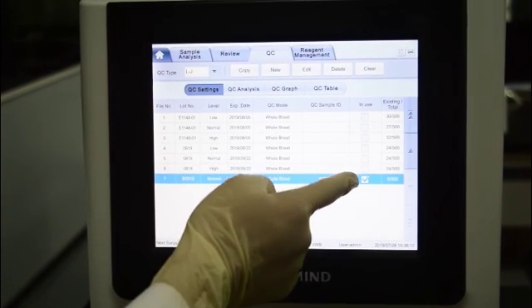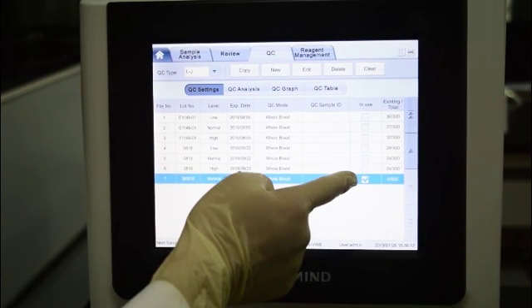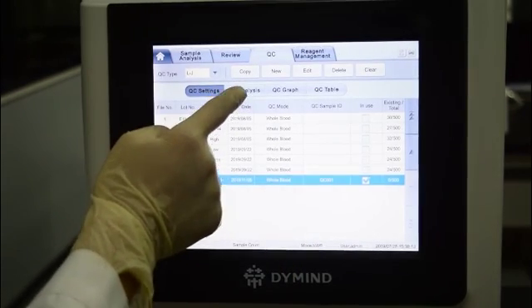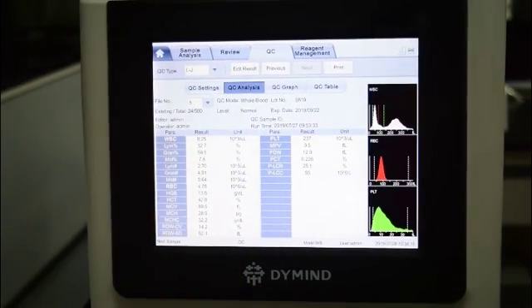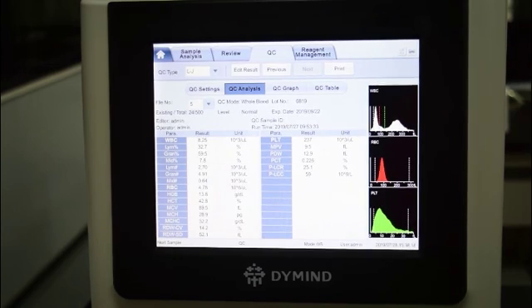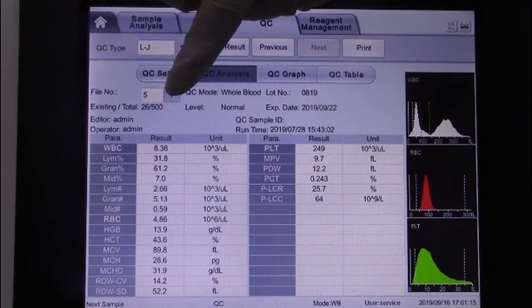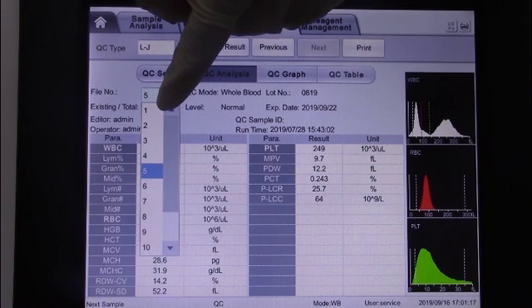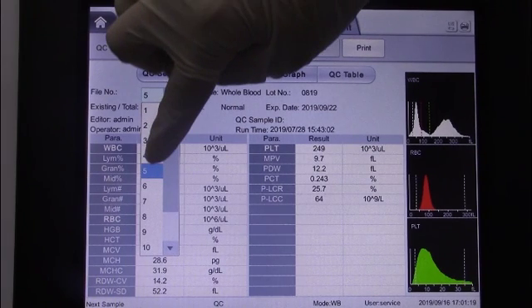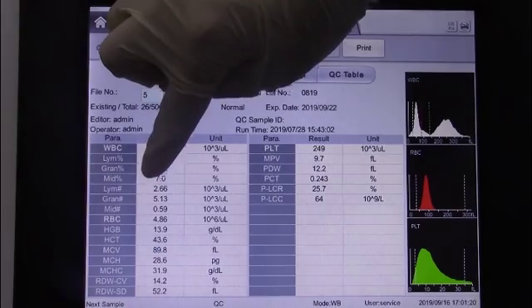Choose the corresponding lot number of QC in use. Click QC Analysis. Choose the corresponding file number which matches the controls.